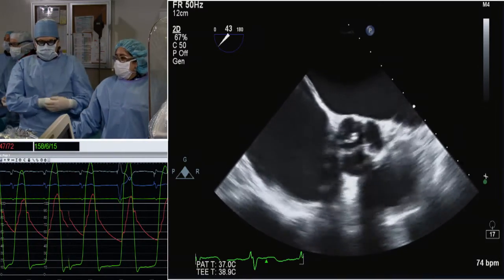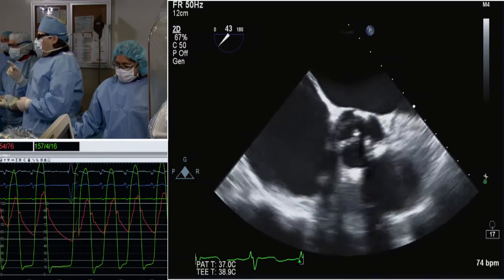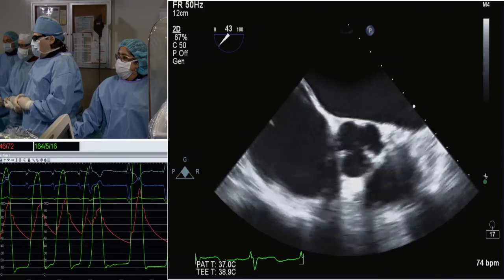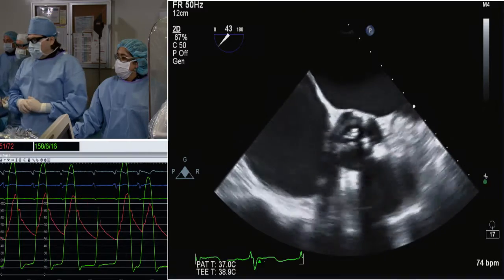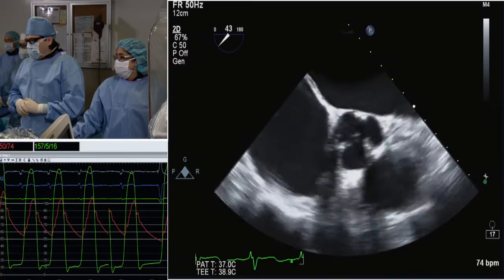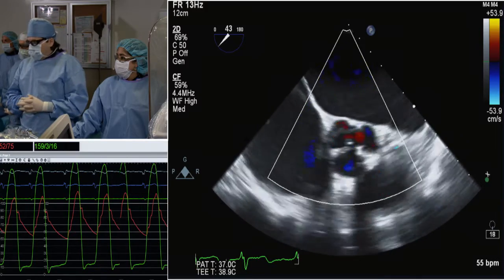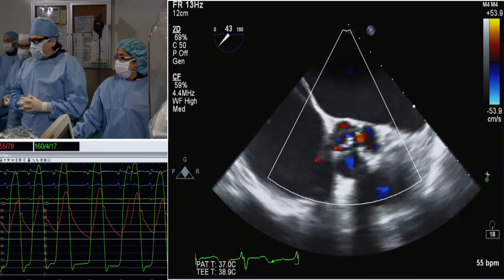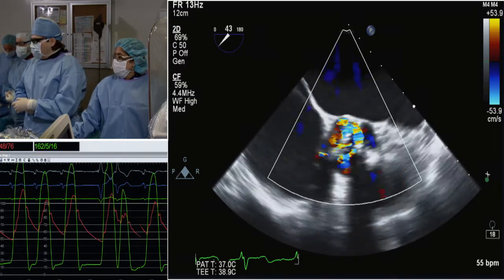the choice of the valve could be oriented based on both the degree of calcification but also the eccentricity of the annulus, where a very simple index, which is 1 minus the minimal diameter over the maximum diameter, provides you with a simple index, and whenever you've got something more than 0.25, that may be associated with more paravalvular leak. And therefore, either PVL prevention technology or post-dilation or circularization, these issues come into play in terms of choice. So I guess it's a great point, John.